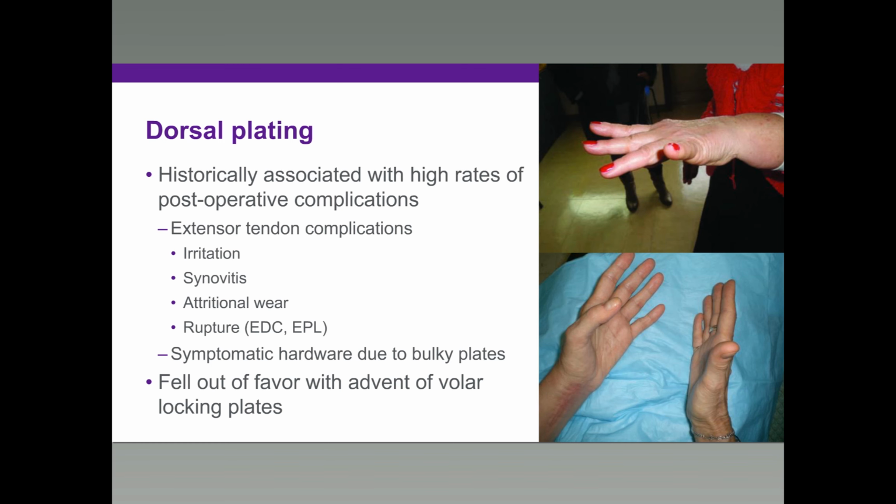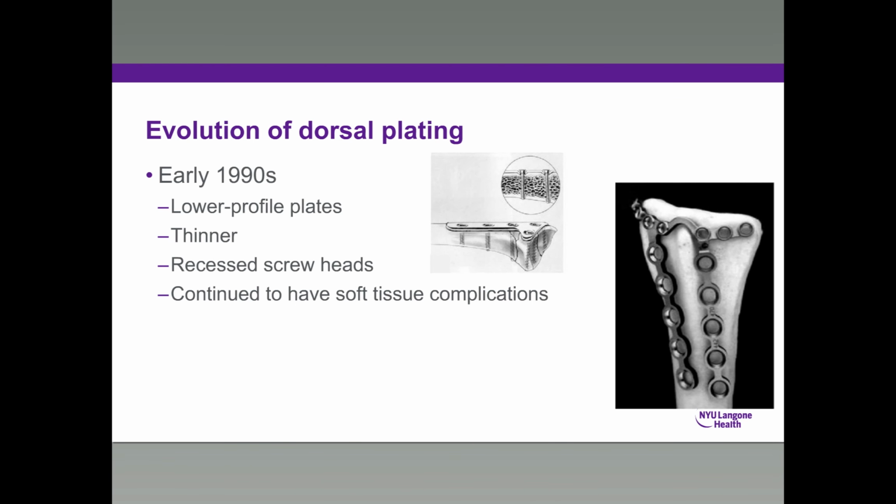When I was a resident, we were putting these things on like nobody's business, and then we just sort of stopped using them. They started to evolve as people realized that they were problematic. In the 90s, they started coming out with lower profile plates. They were a little thinner, and as you can see in this drawing, even the heads were a little recessed, so that the hole was recessed and the screw head would go in it.